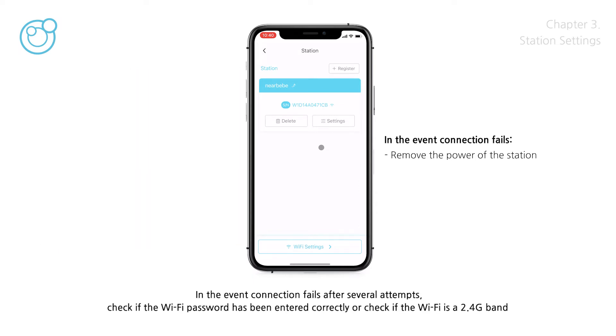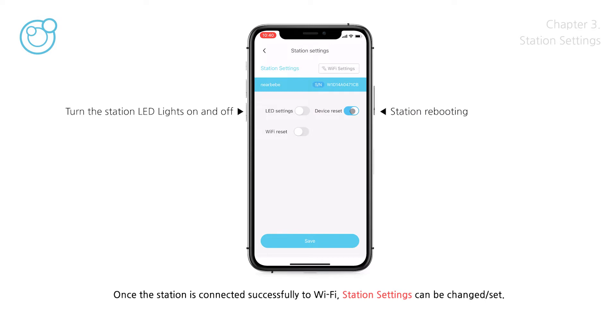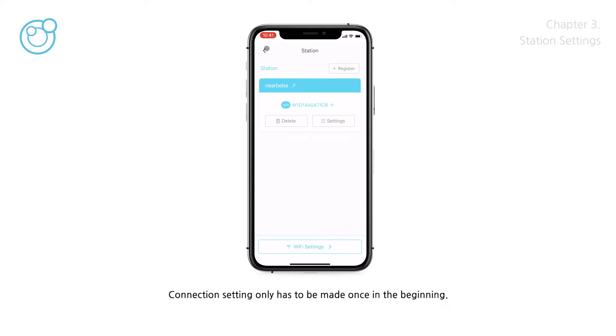In the event the connection fails after several attempts, check if the Wi-Fi password has been entered correctly, or check if the Wi-Fi is a 2.4GHz G-band network. If the connection still fails, please email NearBeBe. Once the station is connected successfully to Wi-Fi, station settings can be changed. Even if the power is removed and reconnected, the connection is made to the previously connected Wi-Fi. The connection setting only has to be made once in the beginning.